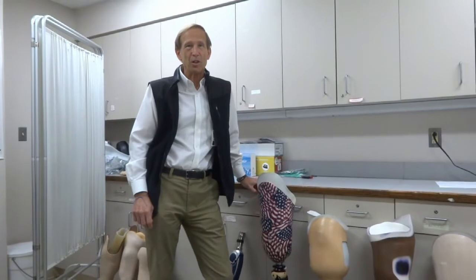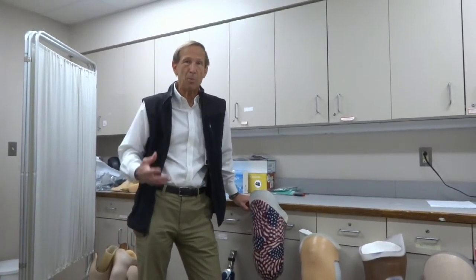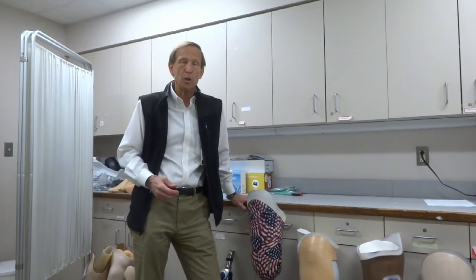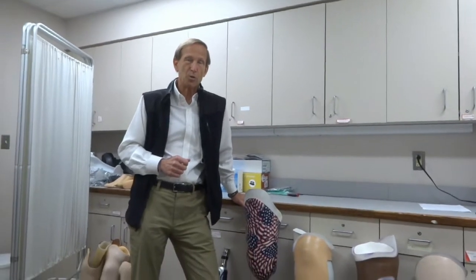Hey, welcome back. It's Dr. Ustall. This segment today, we're going to talk a little bit about prosthetic knees. If you have an amputation above the knee, one of the components we'll be ordering for you will be a mechanical type of knee. There are many different categories and designs, but we'll go through some basic categories. Just like we talked about with prosthetic feet in other segments, there are basically four categories that Medicare has established, and we'll use that as a guideline.